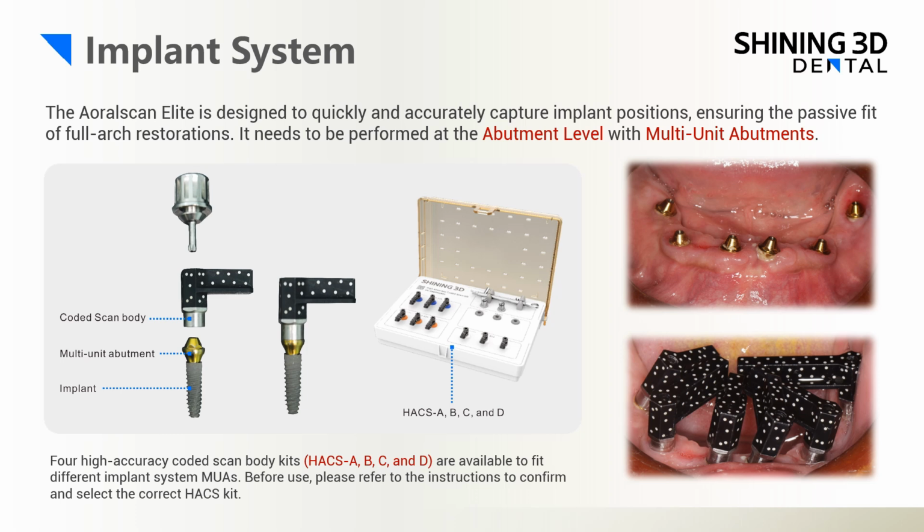The Aoralscan Elite is designed to quickly and accurately capture implant positions, ensuring the passive fit of full arch restorations. It needs to be performed at an abutment level with multi-unit abutments. Four high-accuracy coded scan body kits, HACS type A, B, C, and D, are available to fit different implant system multi-unit abutments. Before use, please refer to the instructions to confirm and select the correct high-accuracy coded scan body kit. Selecting the wrong scan body will result in the coded scan bodies failing to properly sit on the multi-unit abutment.